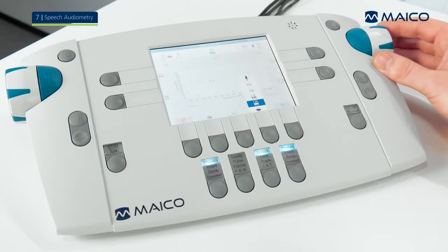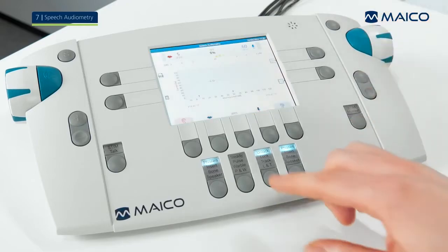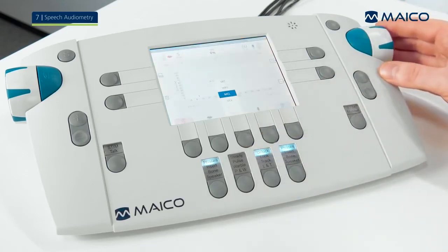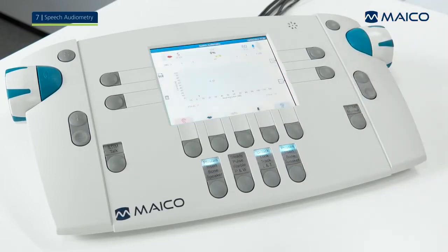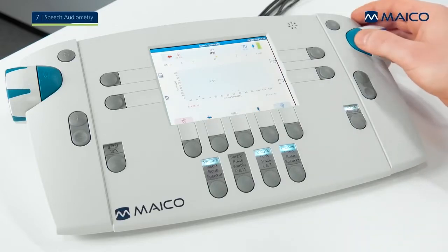In addition, speech tests can be performed with integrated WAV files. Choose the test type. In the speech audiometry, the test types SRT, WRS, MCL and UCL are available. If a speaker configuration is calibrated to the MA42, SRT and WRS aided are also provided for selection. Now select level and present the speech material.